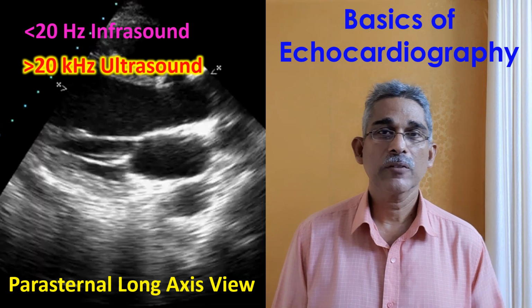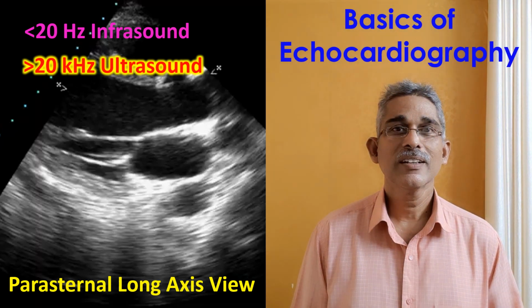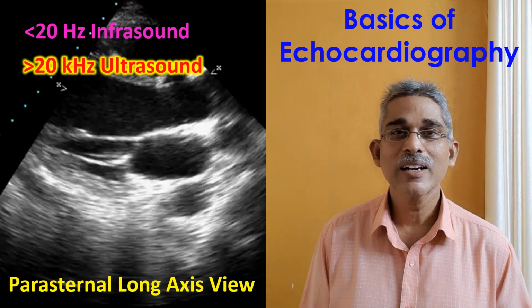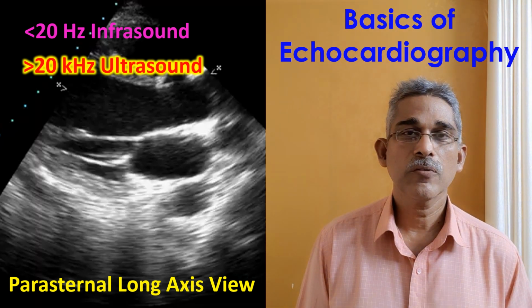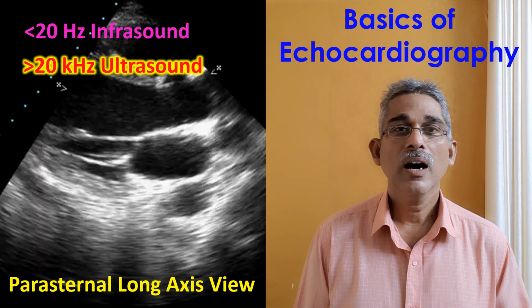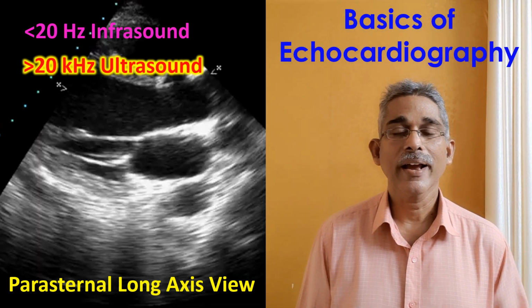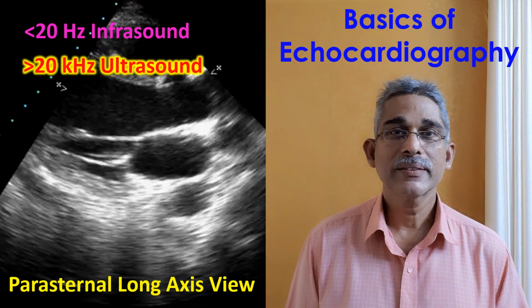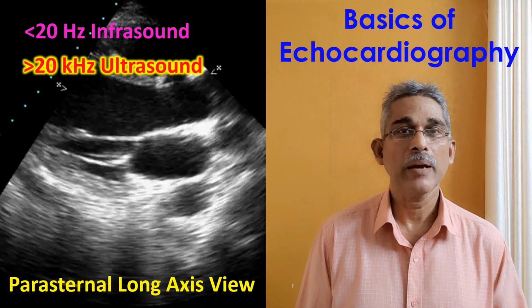Normally for echocardiography, there are certain echocardiographic windows where the heart is not covered by the lungs. Lungs will reflect off ultrasound, so that you will not be able to get a good image. Everything will be white on echocardiogram when you place the ultrasound probe over the lungs. So you have a few places where the probe can be placed.